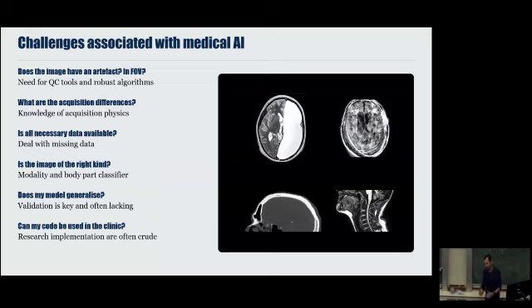And when we come back to the imaging, we've got a lot of challenges to address. It's great to have networks that are dealing with pristine images like we do in research. But if we look at the data that we acquired within normal and routine clinical practice, it's not as sparkly. We've got a lot of artifacts within these images. The 4 images that you can see on the right of the screen here is us going to a PACS, which is an archiving system where all of the images of a hospital are, and asking for T1 weighted MR of the brain. That's what we could obtain. Just exemplar, or normal, T1 weighted MR of the brain.